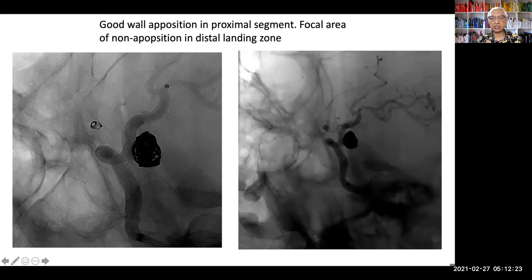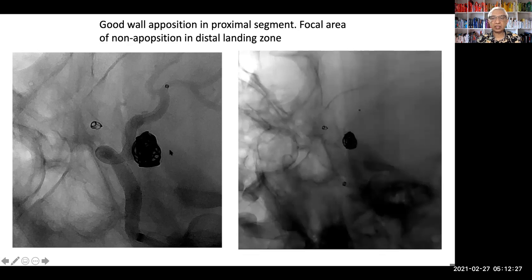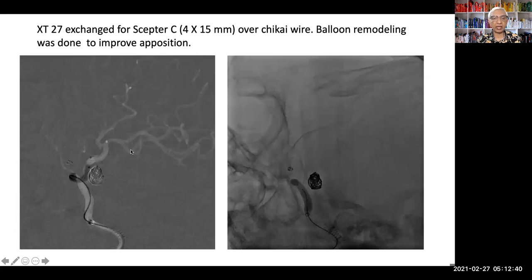So in this situation, if you want to make sure this opposes, the best thing is to first try the massage. We tried the massage, you can see the microcatheter over there, but it was not optimal. You cannot take a Navion across that. It's extremely dangerous. It may actually pull the whole system off or do more damage to it.